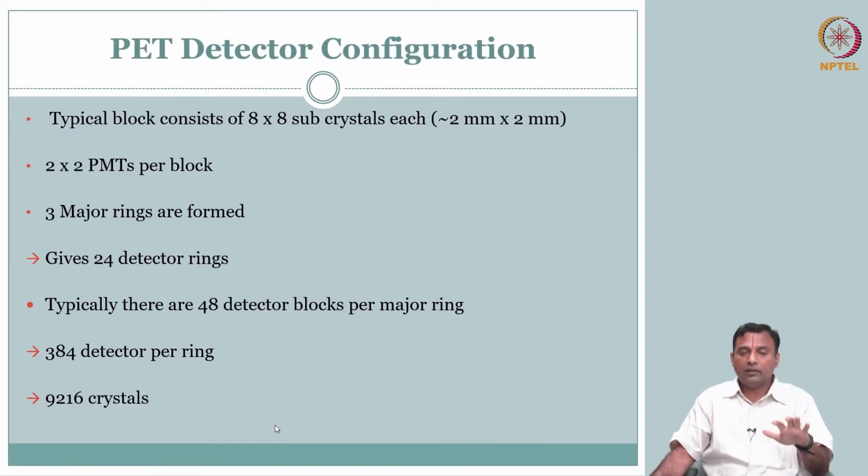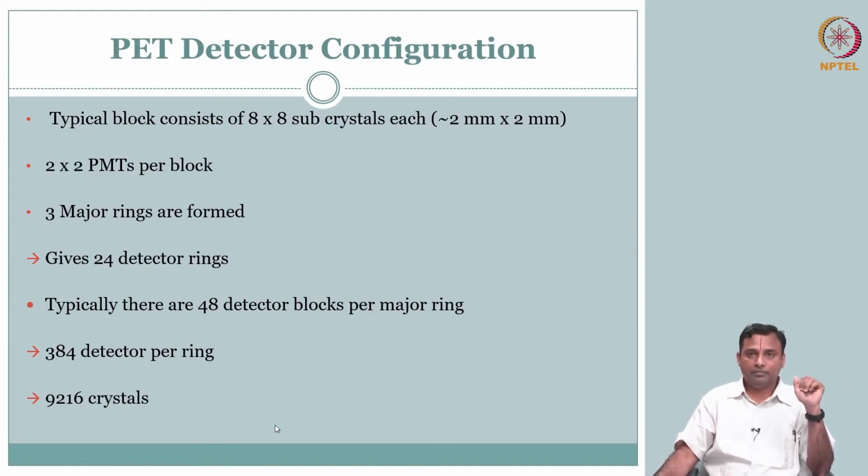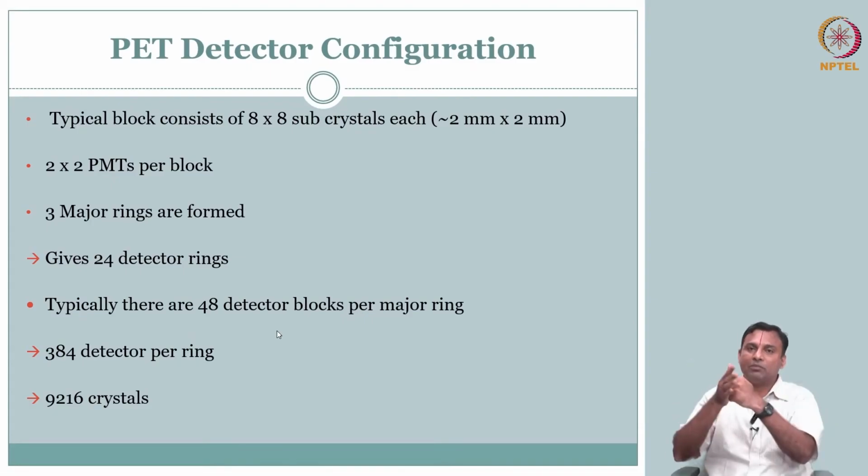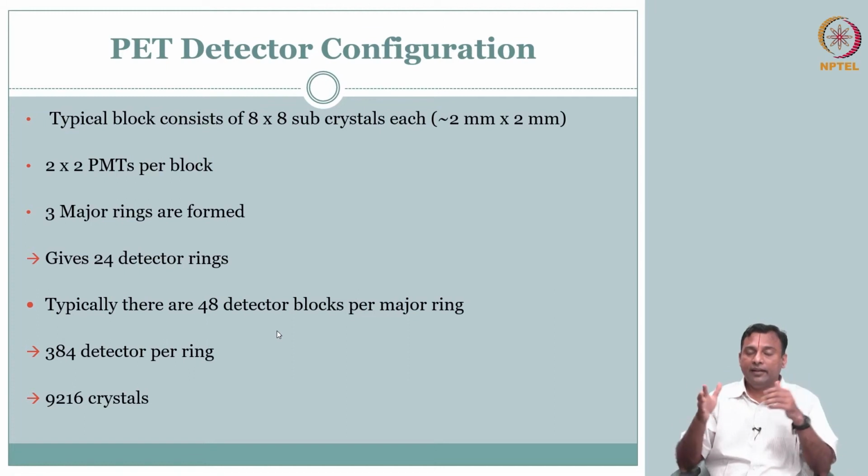So otherwise, the instrumentation, the concept of what each component does, is very similar to what we covered already in planar scintigraphy. Okay. So there is nothing more to the instrumentation part of it. Once we are through with instrumentation, now we are ready. We know the activity happens, it comes and hits the detector, so I can collect right on the detector.